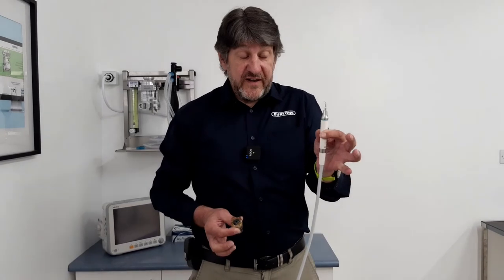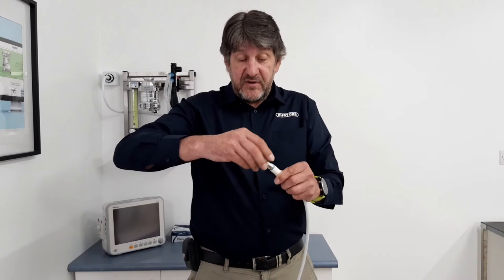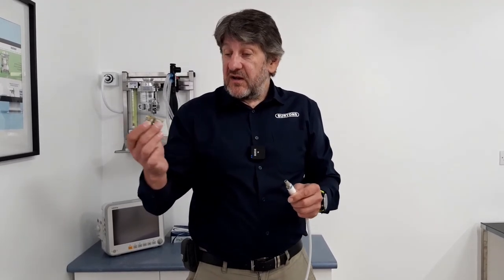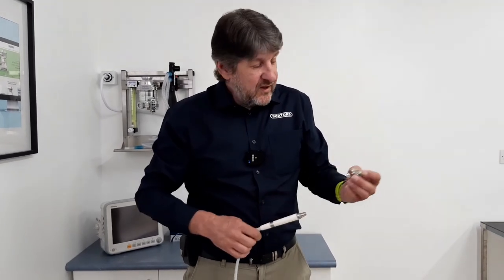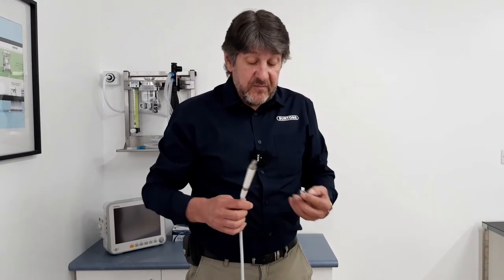To remove the scaler tip, insert it into the torque wrench and then unscrew. It's worth noting that these are all autoclavable and can be set to one side and a new tip inserted.